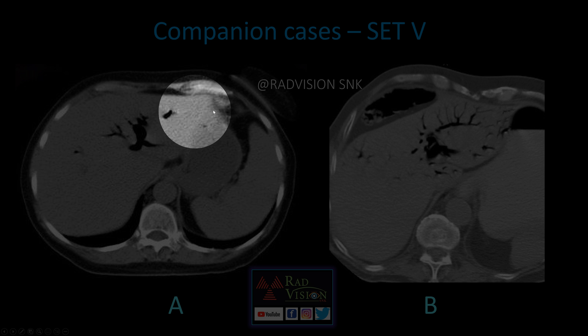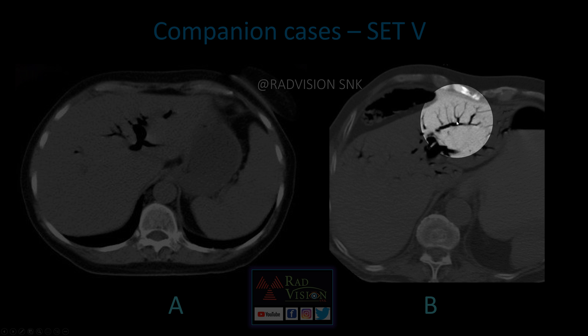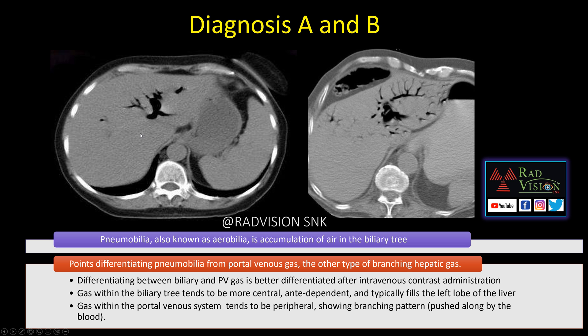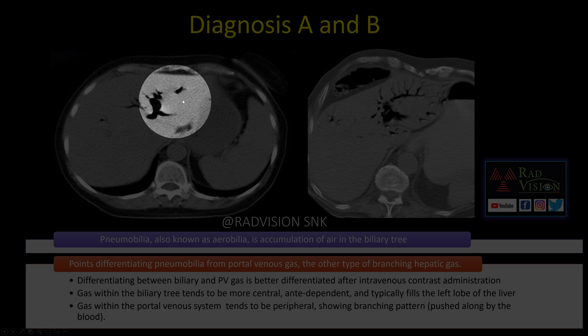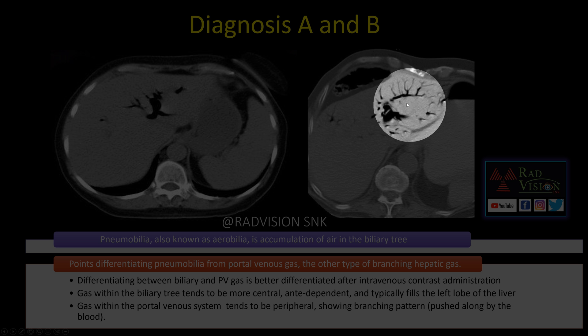Next case: there is central free air in the left lobe of the liver not reaching the periphery — this is pneumobilia. The second case shows free air in both lobes of the liver with a typical branching pattern reaching up to the periphery — this is portal vein gas. After IV contrast, the gas position does not change in pneumobilia, but portal vein gas changes position after IV contrast. Central free air, no branching pattern, not reaching periphery, typically in left lobe — remember pneumobilia.